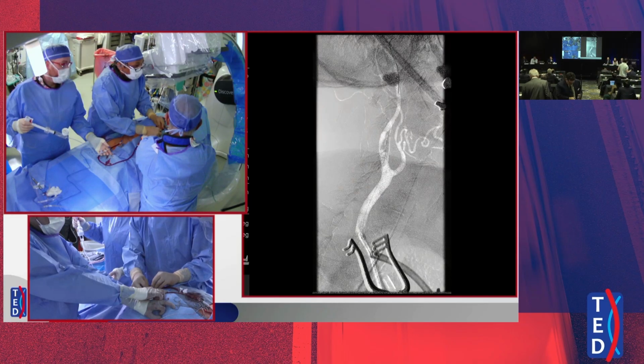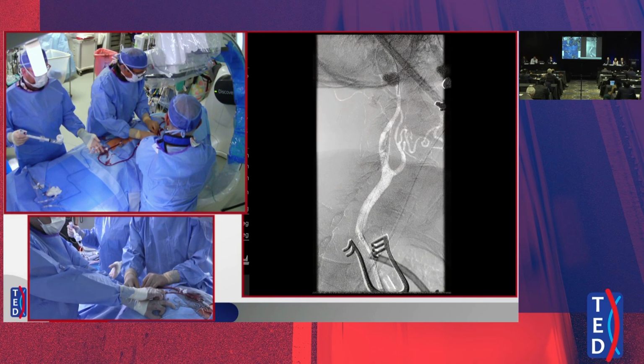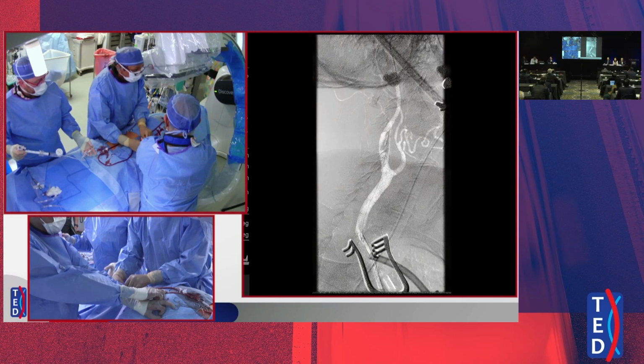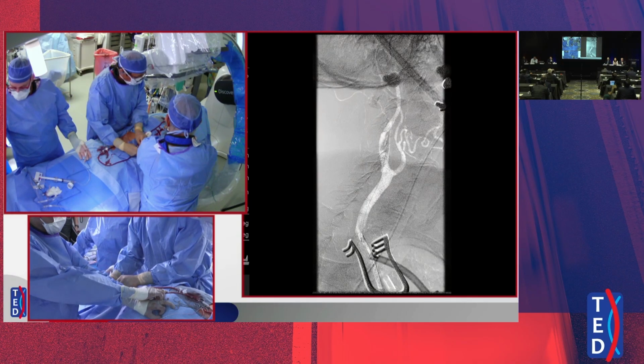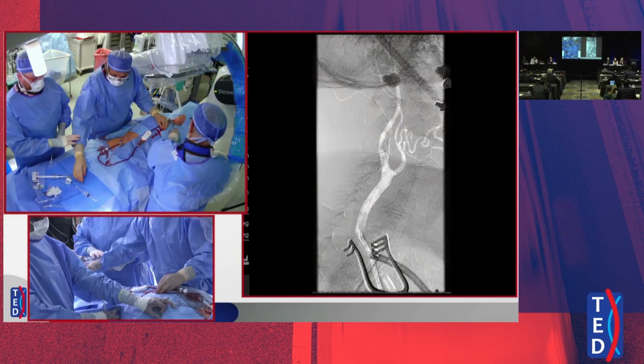Okay, so 84. Chris, can you put up the slides in a minute? Okay, hang on for a second then. Let me get this balloon out of here. We'll take a picture. Heart rate, pressure is all good. Okay, give me some heparin saline.